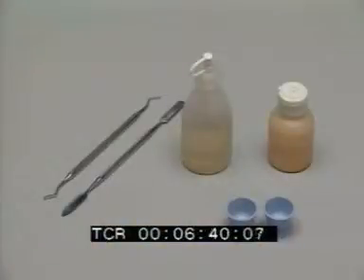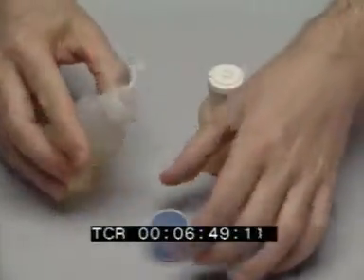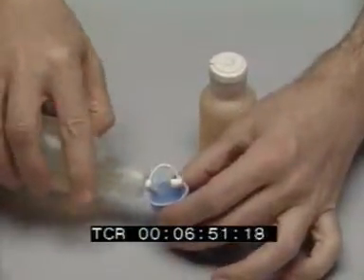For long-term immobilization, tension banding, or the fixation of avulsed teeth, the use of methylmethacrylate is recommended. Monomer is placed into 2 mixing containers.